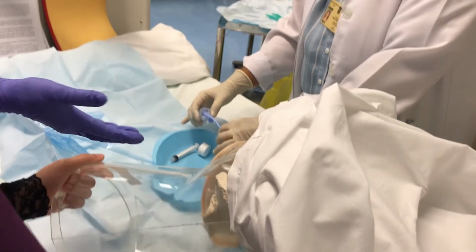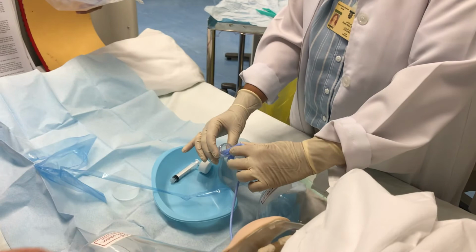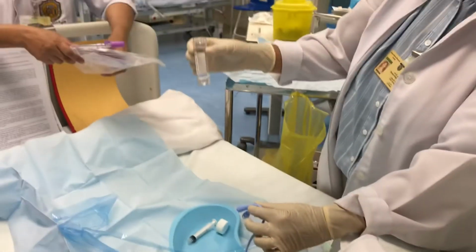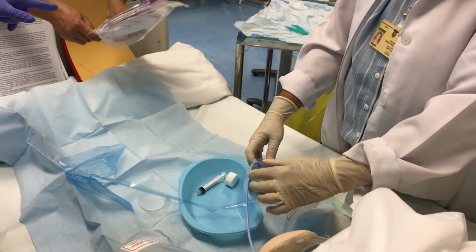Actually, maybe they can put yellow color and make it look like real urine. Today I think we forgot. I don't think it's coming because it's higher. Okay, so we will be collecting urine and then connecting it to the bag.